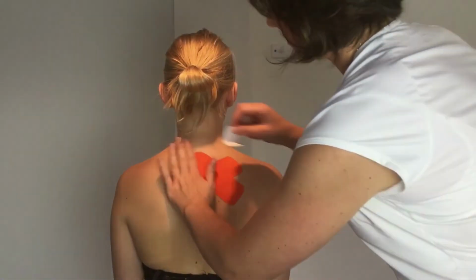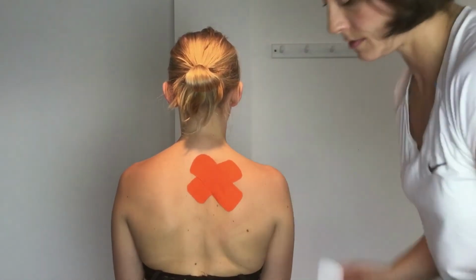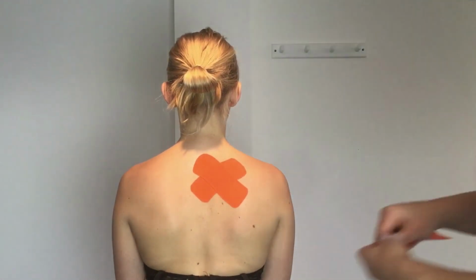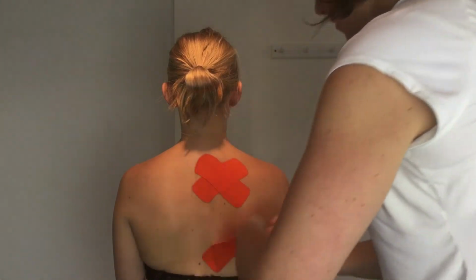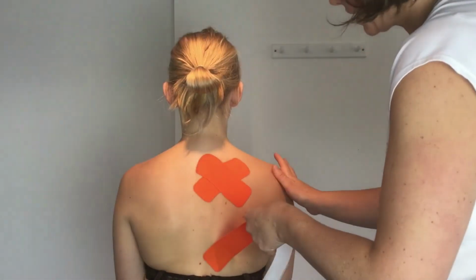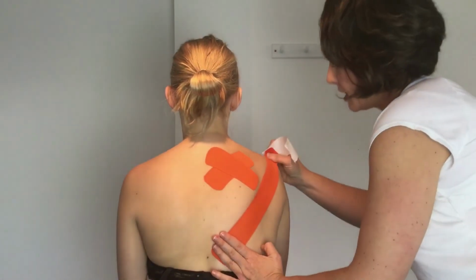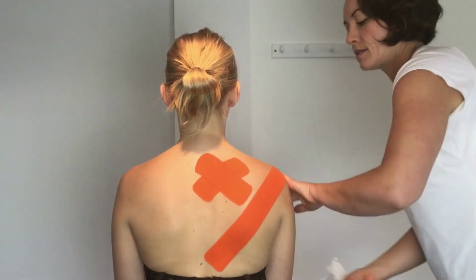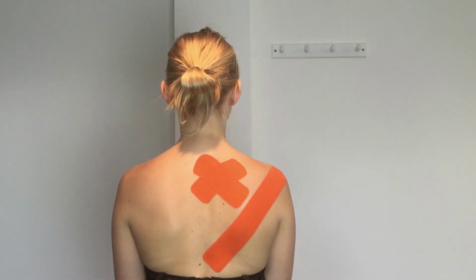But this is often caused by that shoulder blade being rotated away, maybe winging away from the thoracic cage. So adding a stabilising functional taping can really help with this to offload the rhomboid tissue. So anchor the tape off the scapula towards the spine. We're going to do a functional taping, so a medium amount of stretch, so a good stretch on that tape. Bring the shoulder and shoulder blade forward, lay that tape down across the whole length of the scapula. Client relaxes and then anchor with no tension. That's going to help to pull that shoulder blade back and take the pressure off the rhomboid.